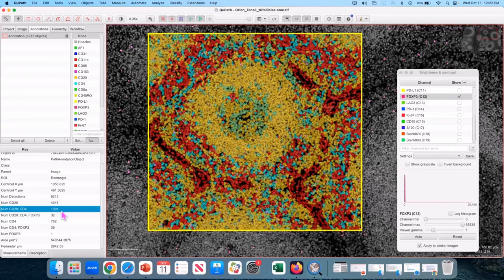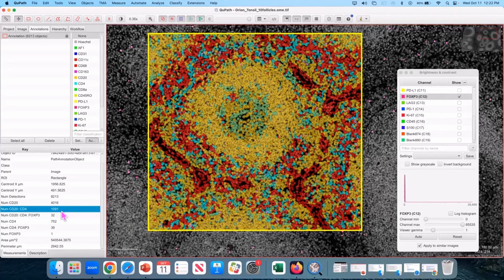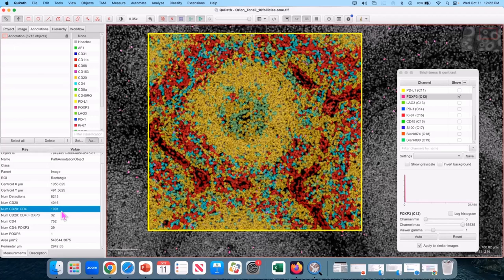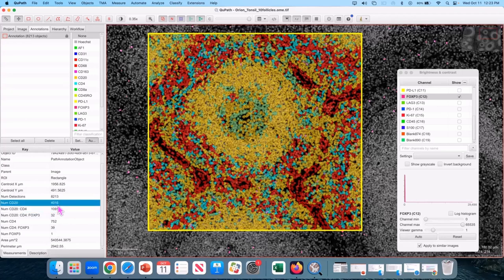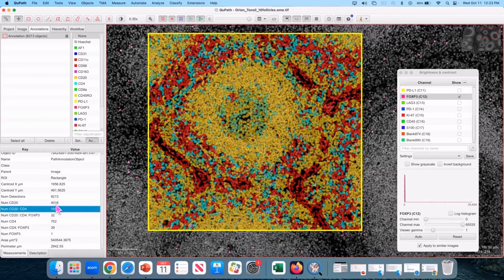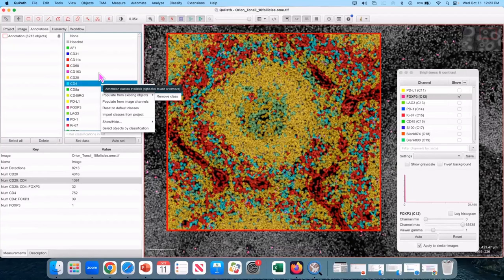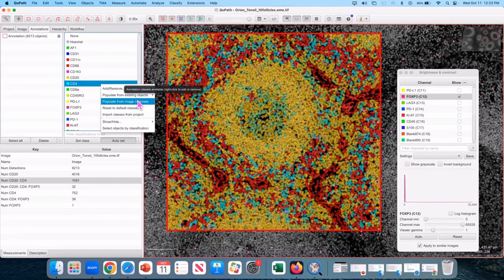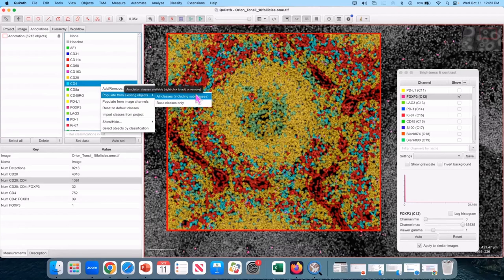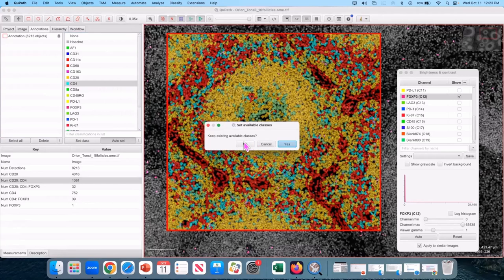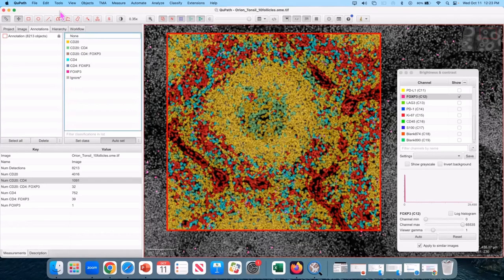There are better methods of that. Like distance metrics if you really want that information. This is just kind of uncomfortably, you don't really know what it is. I wouldn't use this as like a readout in a figure. What I would do is try different segmentation methods, see which one gets you the least crazy results. And it's also a way, it's a sensitivity test. In this particular case, I know 12% of my B cells are wrong. So I better not be quantifying any differences. I'm going to go to my class list and instead of populating from the images, I'm going to populate from my existing objects without keeping available classes to make this a little cleaner. Here's all the choices. Here's every cell.